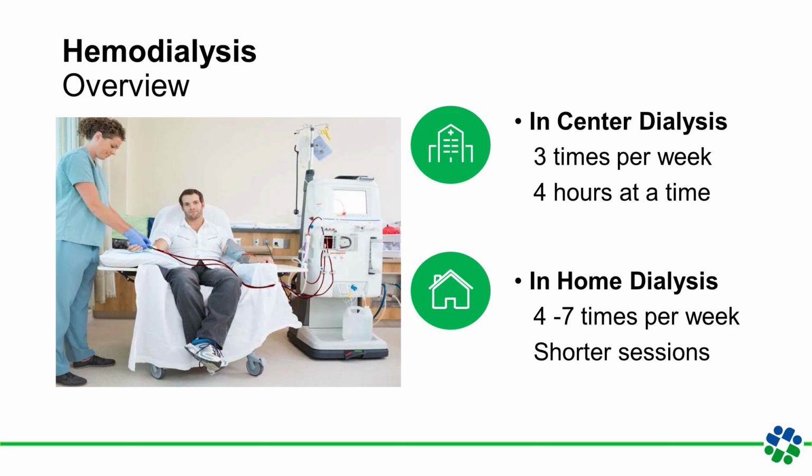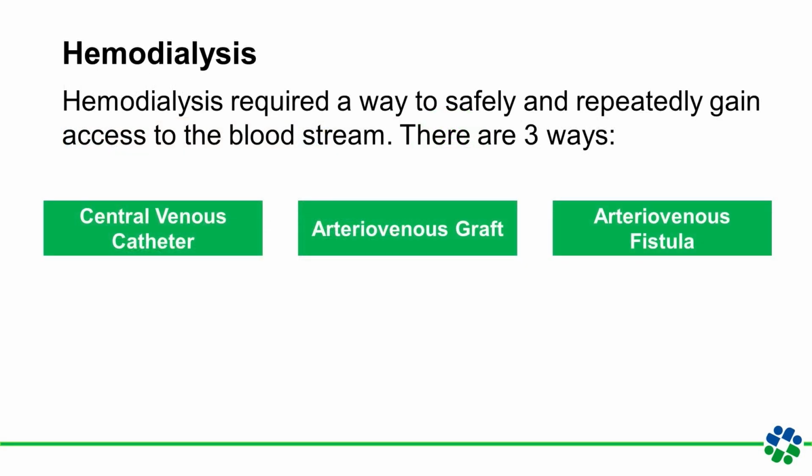The choice, however, between in-center and home dialysis can depend on a host of various factors, such as your lifestyle, your personal preferences, and even your medical condition. Both options, however, are designed with the aim of making the dialysis process as seamless and efficient as possible, always prioritizing your health and your convenience. Prioritizing optimal health care. To perform hemodialysis efficiently and safely, we need a reliable method to access your bloodstream repeatedly.